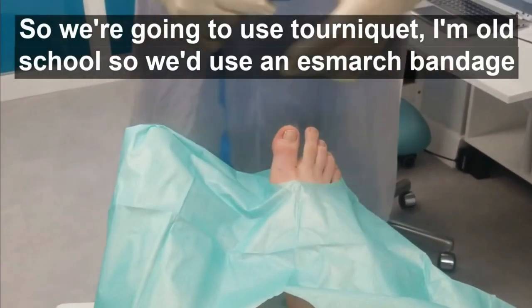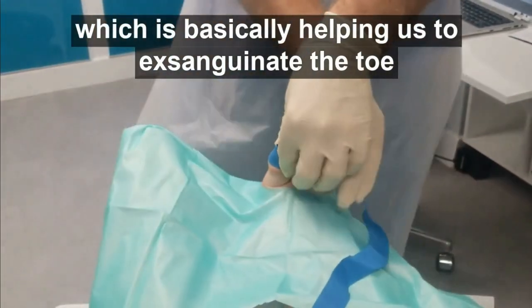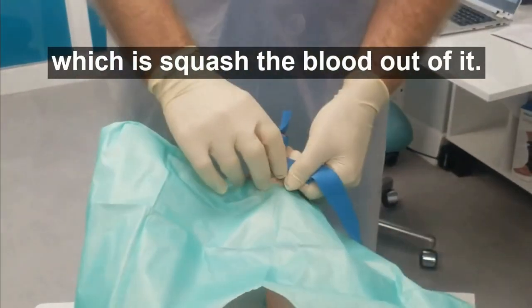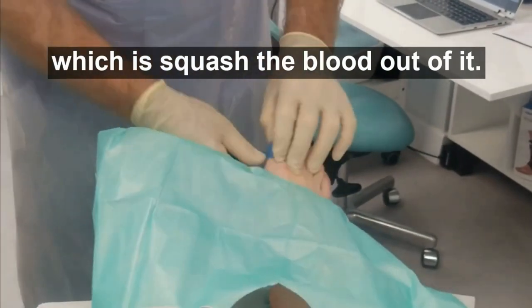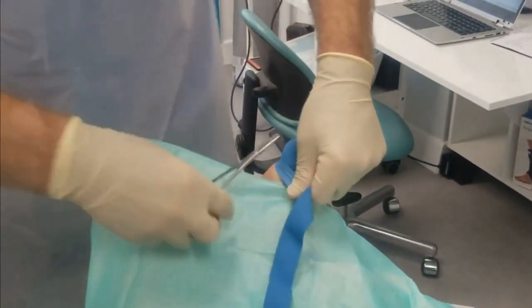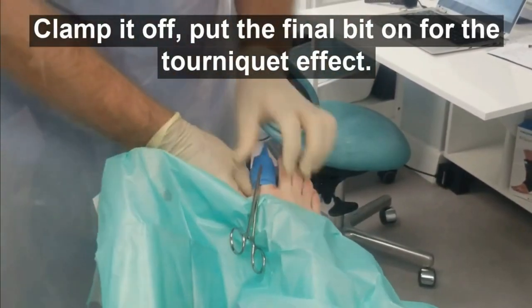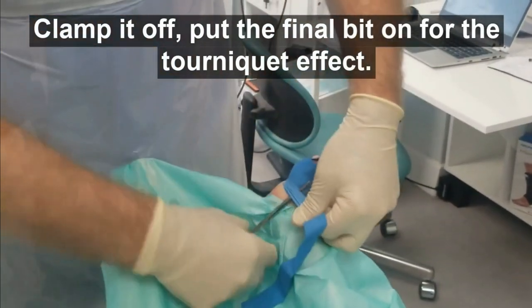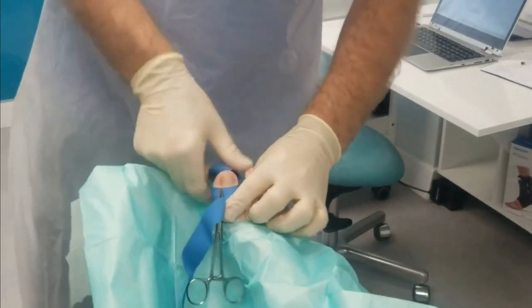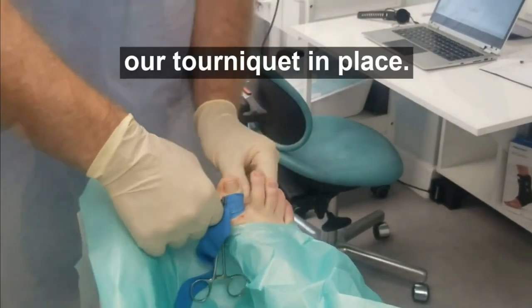We're going to use a tourniquet — I'm old school, so we'll use an Esmarch bandage, which helps us to expunge blood out of the toe, squashing the blood out of it. Then clamp it off and put the final bit on for a tourniquet effect. And there we have our tourniquet in place.